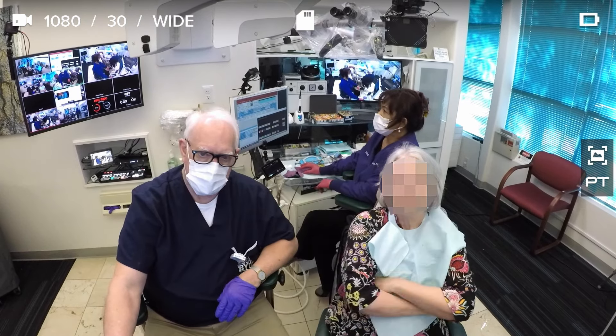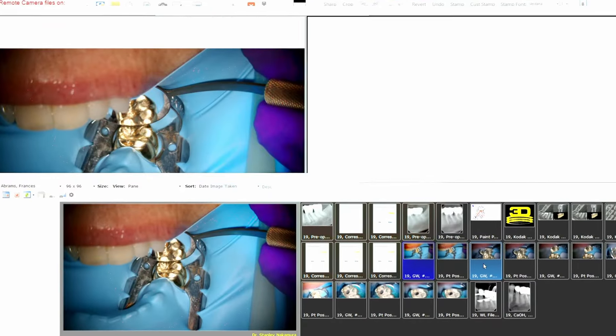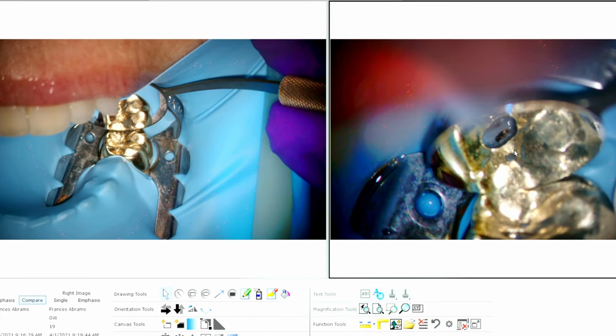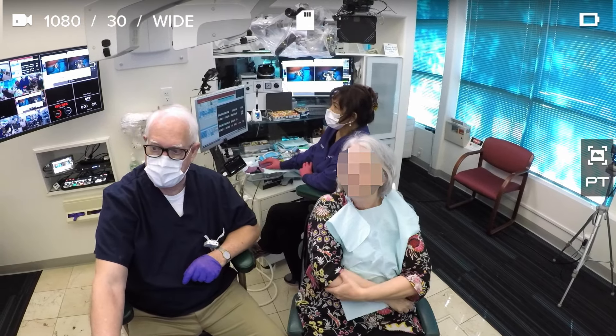So this is what I see. Before we start, this is a mirror. Then I make what we call a minimized access, because I want to take as little tooth structure away as possible.